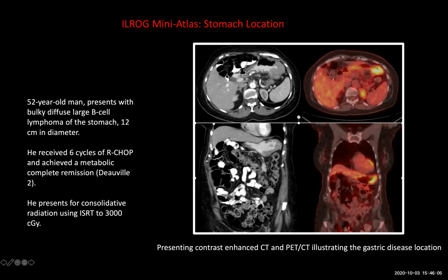This is the PET scan that showed the disease originally, as well as the CT thickening that you can see here in the stomach.